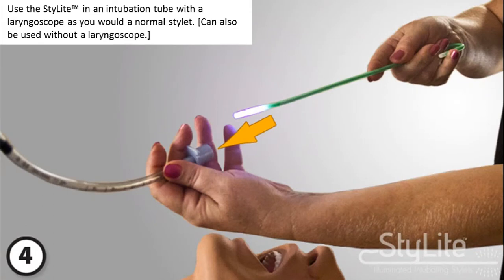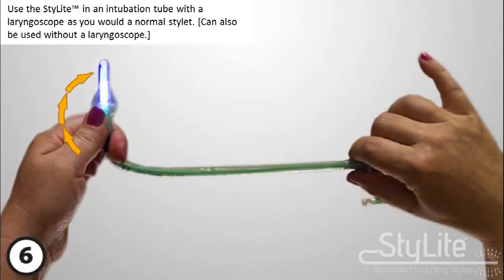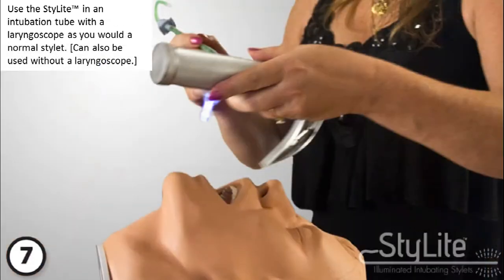Use the stylet in an intubation tube with a laryngoscope as you would a normal stylet. Note that it can be used with or without a laryngoscope.